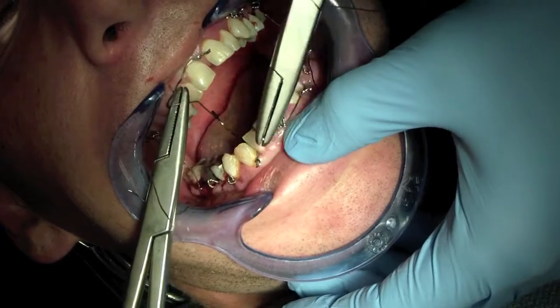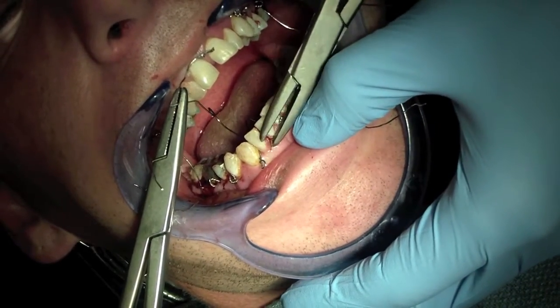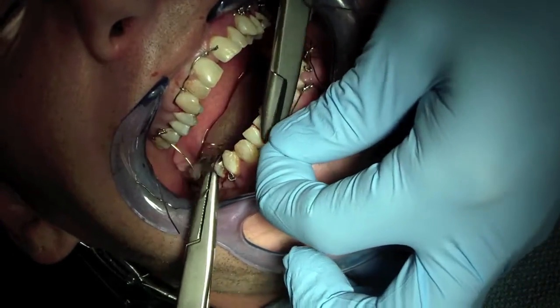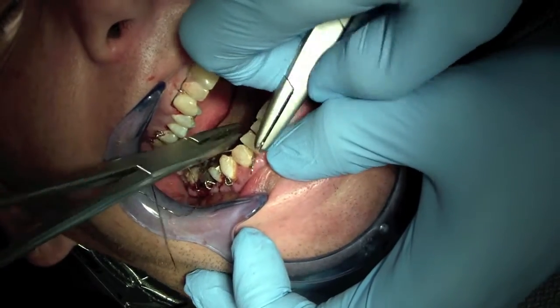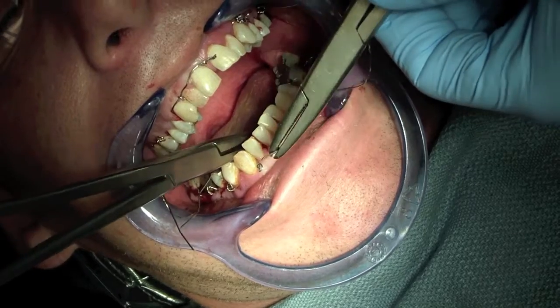That's my dental assistant's Hagar forceps. What's happening right now is it's getting bunged up because there's a kink in the wire. This is 24 gauge wire, so it's really helpful to have another set of hands to try to straighten it as you pull it forward, and then it will come.